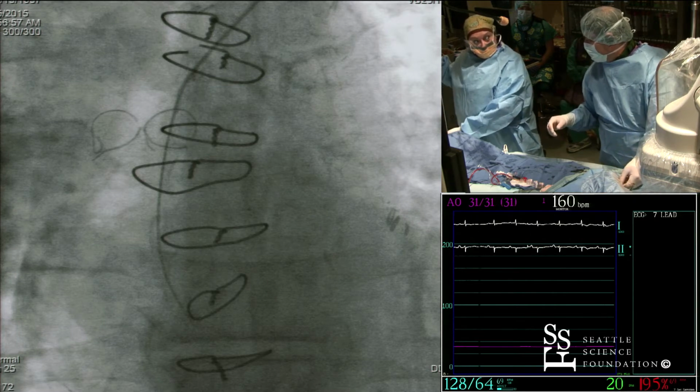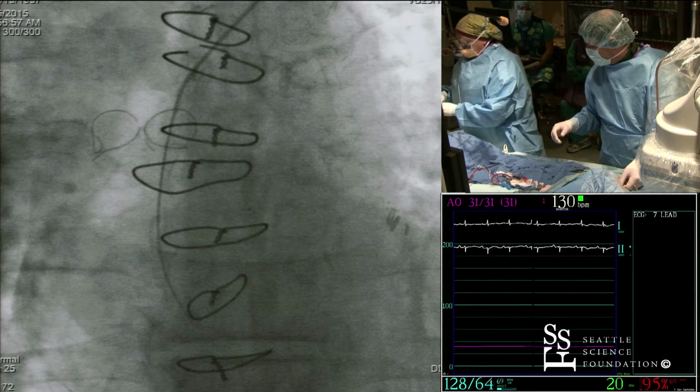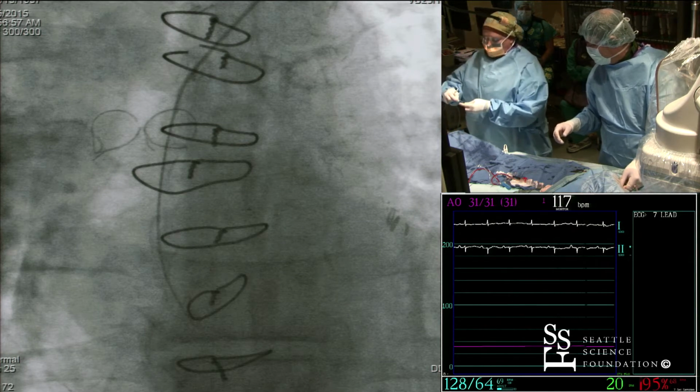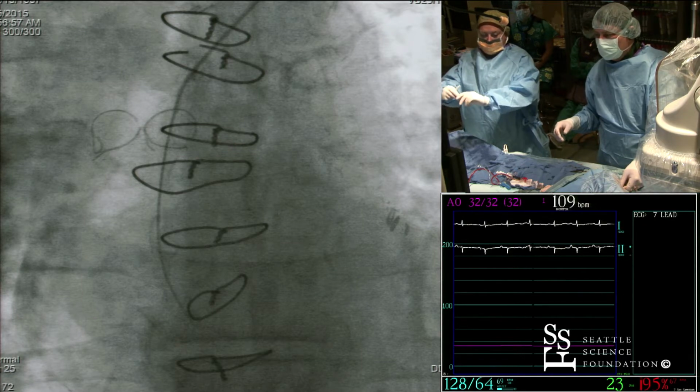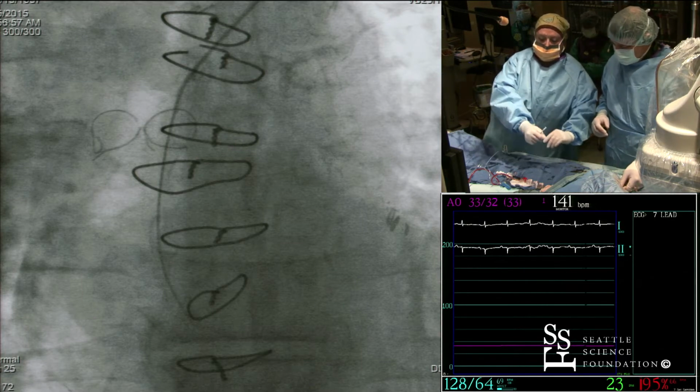Multipurpose, yeah. So again, if you're changing out blindly, which is what we usually do, and they start having PVCs, then your wire is flipped across the valve. So just pull it back.